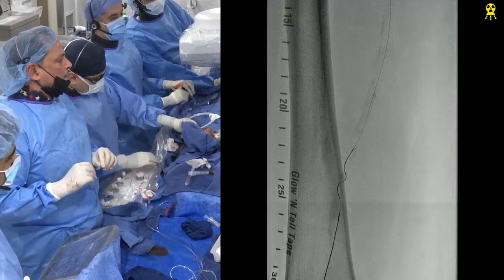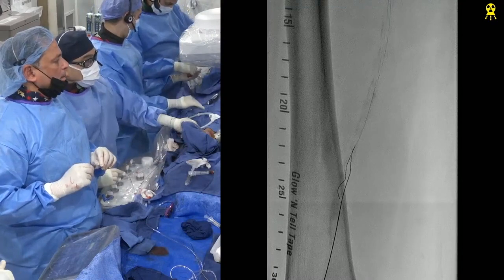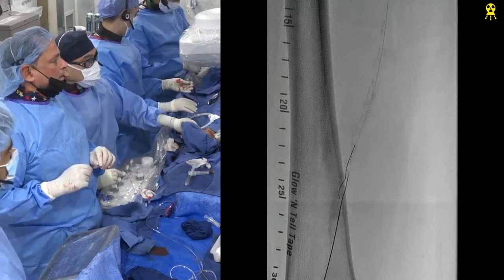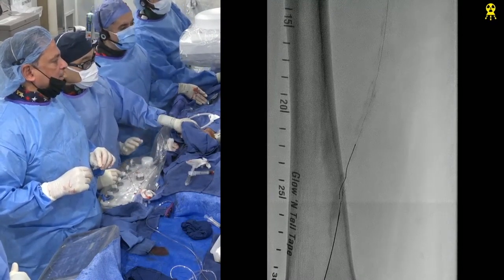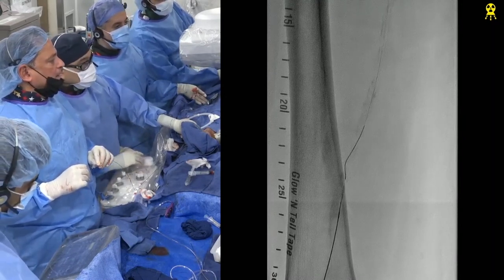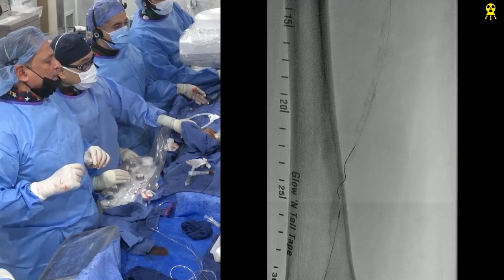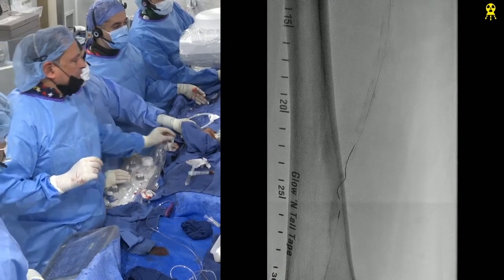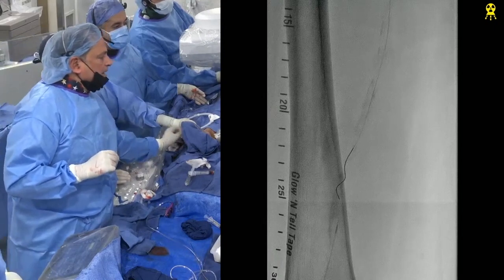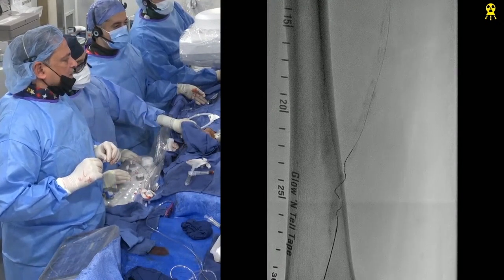So then the next question is, I assume we would finish therapy of this segment of vessel before treating the CFA, right? Oh, yes. Definitely. At least ballooning it. As you can see, it's not easy. I think he's going to need some support. I'm going to have Ray just pull it back a little. See, he needs support up there. So it's not going to cross.